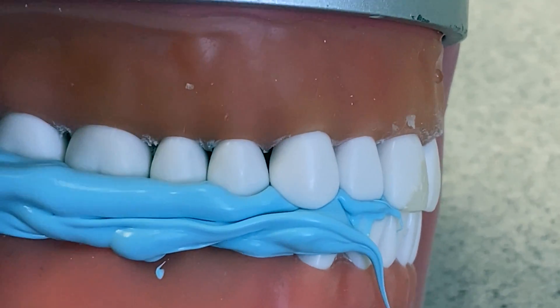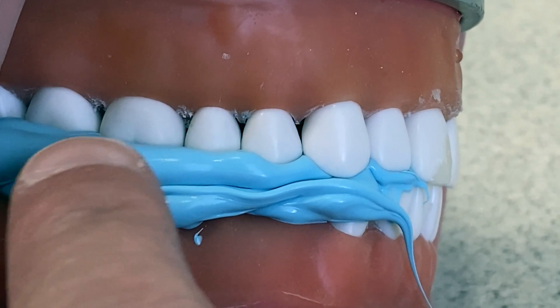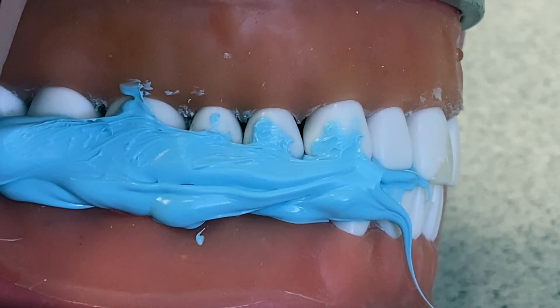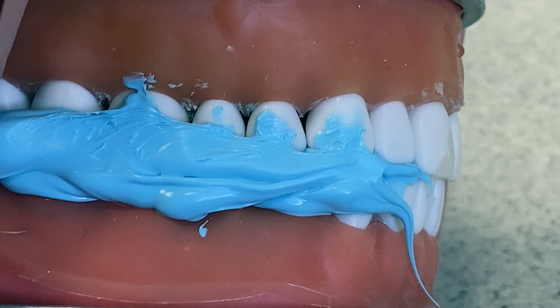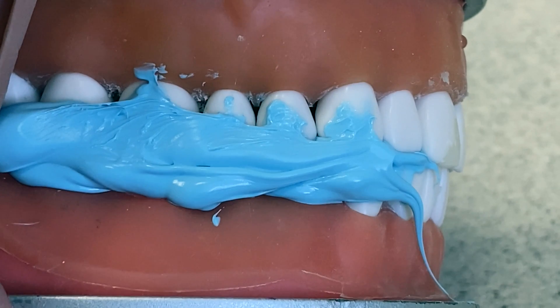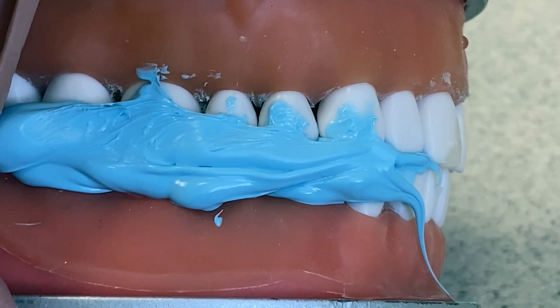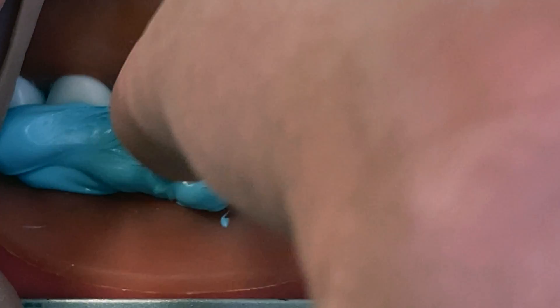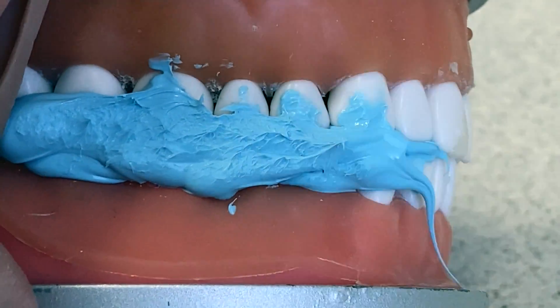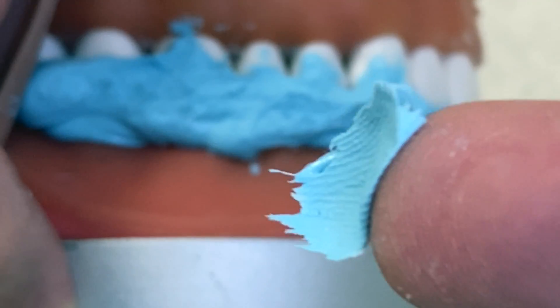This material tends to set pretty quickly — within 45 seconds sometimes. I'll also be working the jaw a little bit, playing with the tissue of the jaw to push it more against the teeth. That's called muscle molding — it gets a better fit to the teeth, though everybody does it a bit differently. Our materials generally set faster when it's warmer. So in the summertime when it's warm, this will set faster. 45 seconds is the usual time, and we are getting close to that, so I test it. It's a little bit softer right now since it doesn't have the warmth of the mouth to help it. On my finger it's actually peeling because my finger is warm.